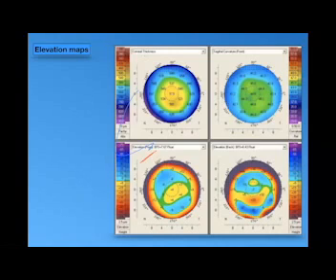So these two signs, the tongue protrusion and the very high posterior elevation in this point, is highly suspicious, and you will correlate it with the sagittal curvature here. You will find here in the sagittal curvature for the same patient or for the same eye is 44.8, which is not steep. Then the coinciding point in the superior part, which is 45.